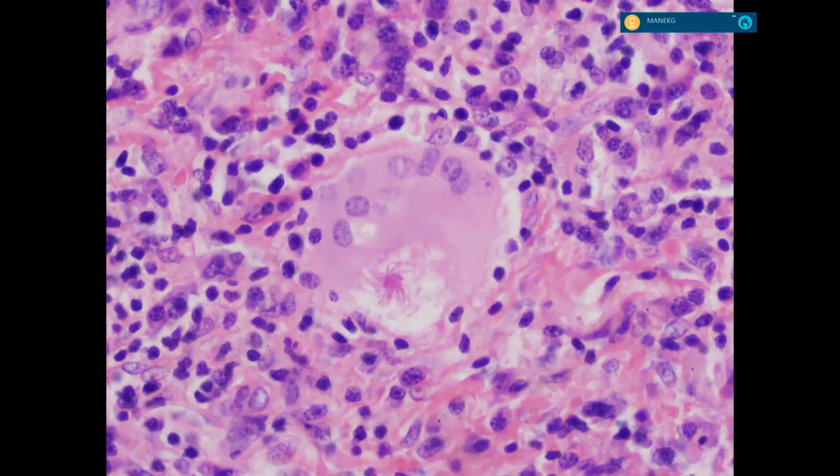So, multinucleated giant cell. Something inside it. It's eating up something. Do you know what that is? They might give you this, and it's actually not at all accurate, but in this case, they might even have an asteroid body. It might have a fungus inside it.